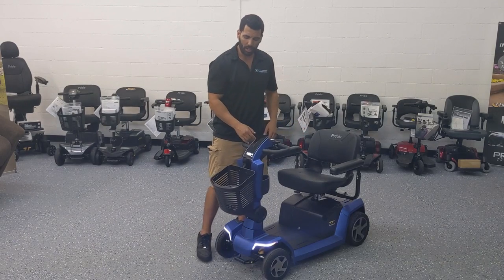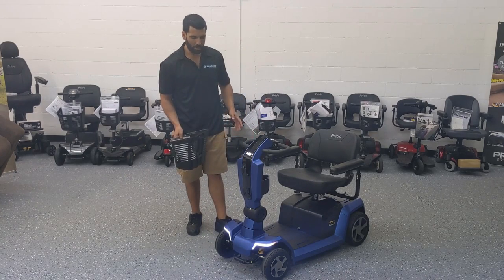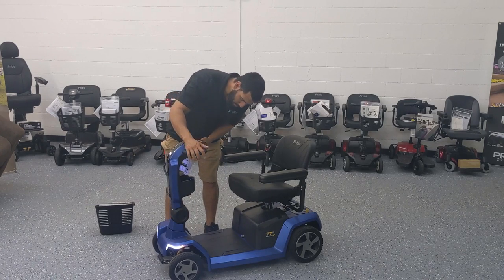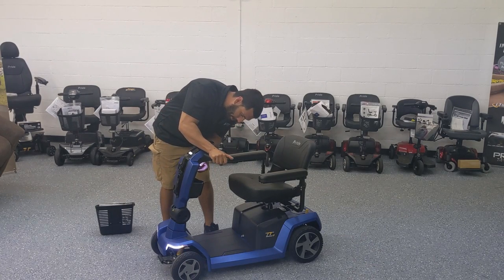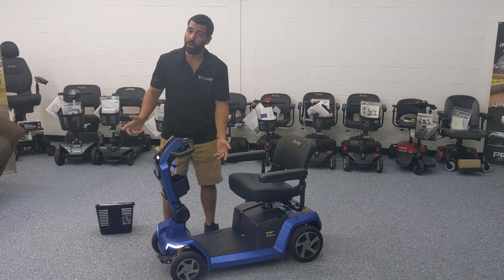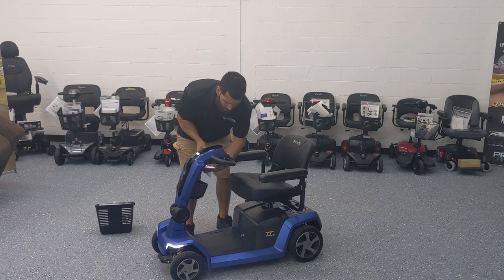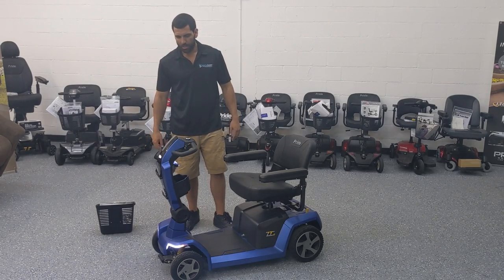Just like all the Pride scooters, it comes with a removable basket that pops on and off. I'll leave the basket off for now and show you a couple of other features before we begin disassembling it. Right under the dash you've got a lever that controls the infinite adjustment on the tiller — you can extend it out pretty far if you've got really long arms, or bring it in if you need less reach. When you're taking it apart, you'll use that lever to bring the tiller all the way down.